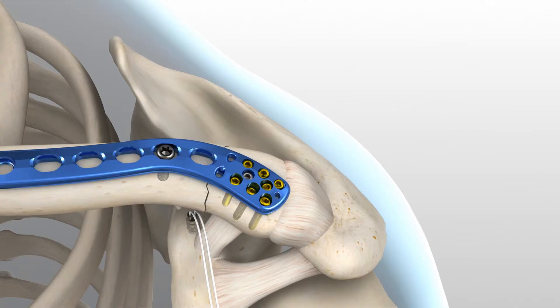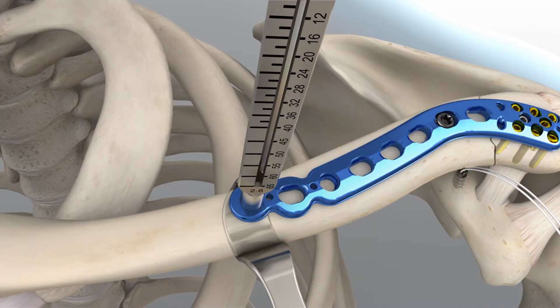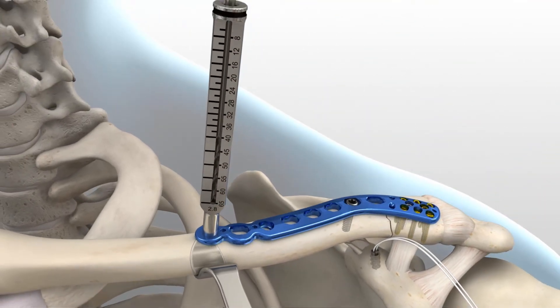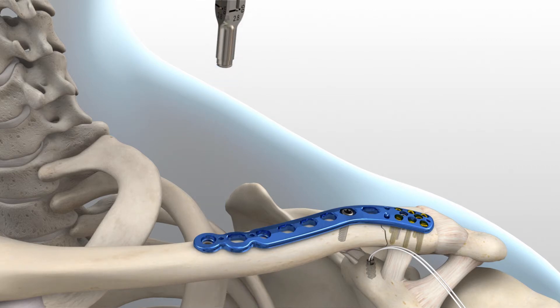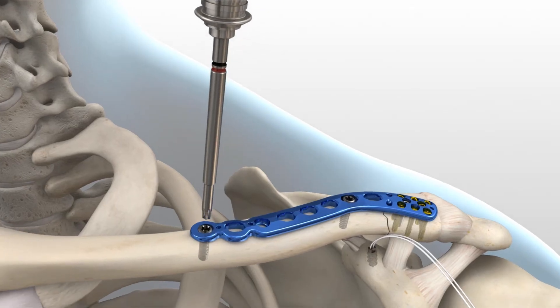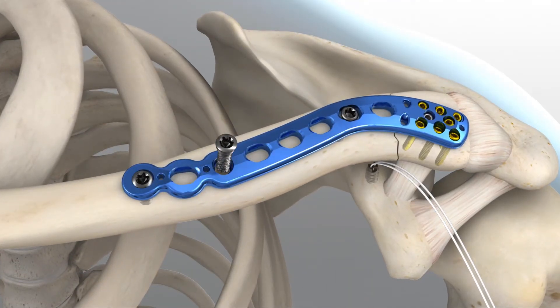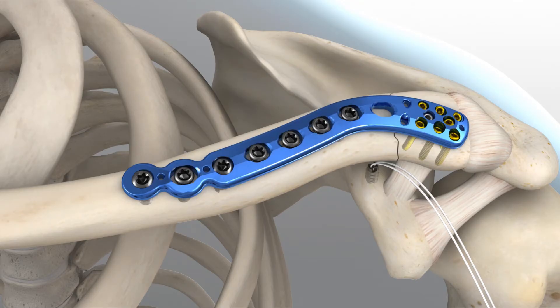To drill all locking shaft holes, place the 2.8 mm locking drill guide into the desired hole until the guide fully threads into the plate. Insert the 2.8 mm drill to the desired depth. When between sizes, it is recommended to choose the shorter screw option. Remove the locking drill guide and insert the proper length 3.5 mm screw. Advance the screw until the head fully engages the plate. 3.5 mm locking hex or hexalobe screws can be used in the locking holes in the shaft of the plate. 3.5 mm non-locking hex or hexalobe screws can be used in the non-locking holes in the shaft of the plate.